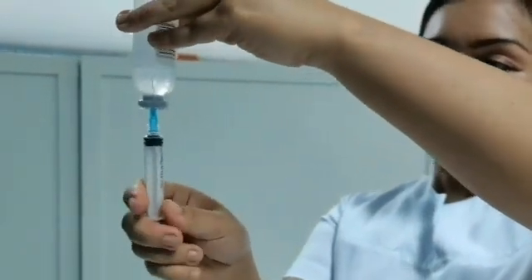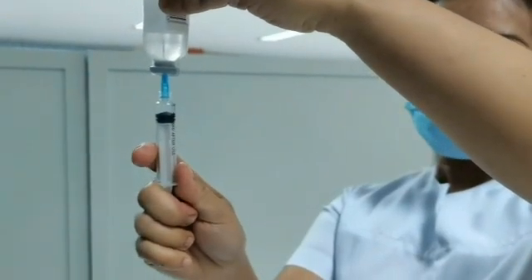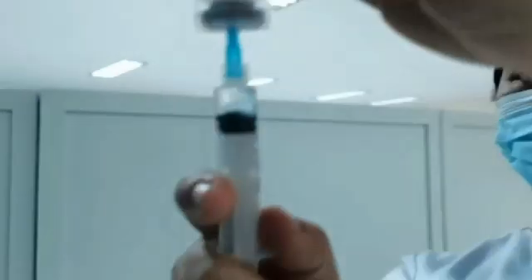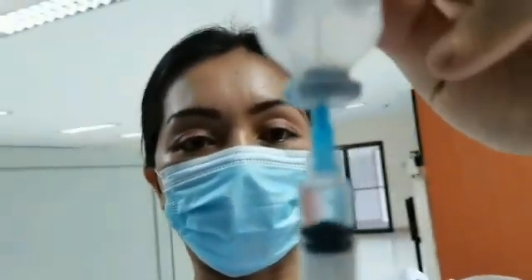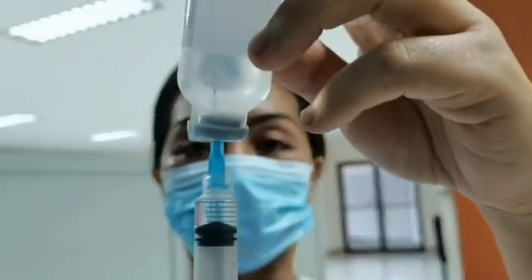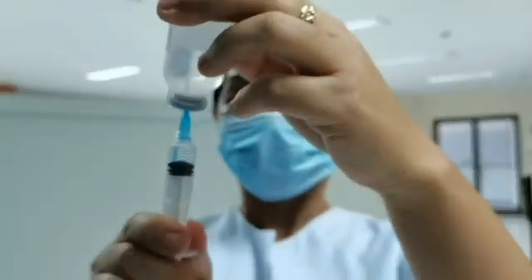Pull needle or spike back to point at which tip is beneath fluid level. Keep needle or spike beneath fluid as long as the fluid is beneath the hub. And slowly pull end of plunger back until appropriate amount of solution is aspirated into the syringe.